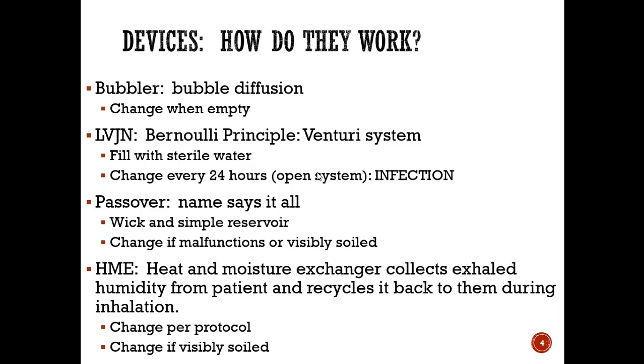The next thing we're going to talk about is the HME, and that's short for heat and moisture exchanger. There's a couple examples of those we're going to see in lab, but essentially it's a small device that sits in line with your vent or on a trach, and it recycles your own exhaled air. I always try to think of the comparison of if you ever have put a scarf over your nose and your mouth in the wintertime and you're breathing out into that scarf and you don't pull it down, it collects moisture and it starts to get damp, and then also it can help to keep the air that you're breathing warm and humidified.